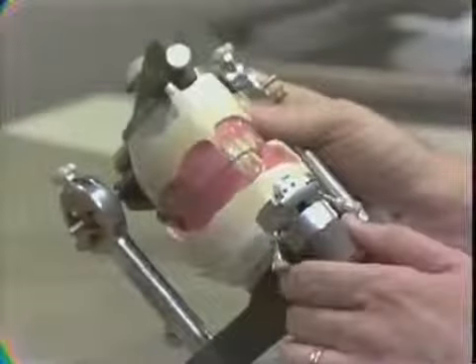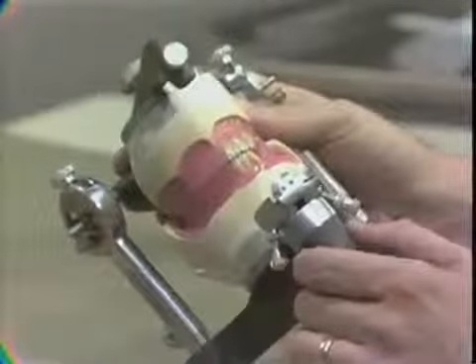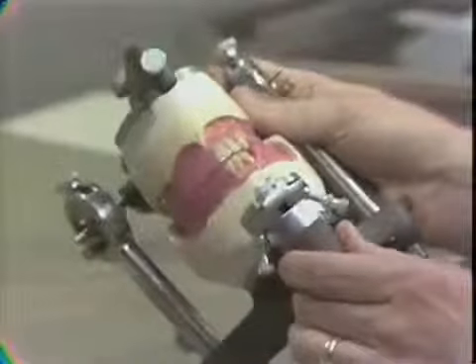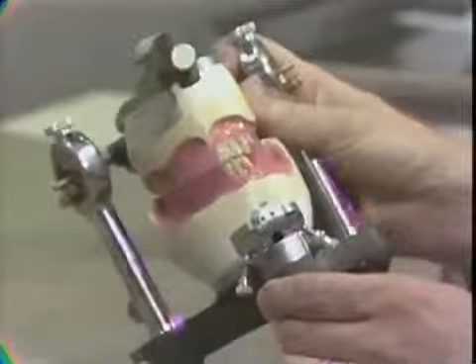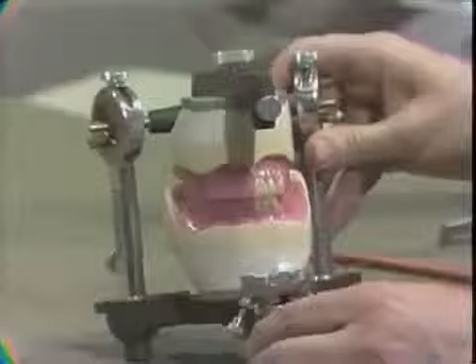In review, the maxillary and mandibular incisors have been arranged on one side of the midline with the desired incisal relationship of 1 millimeter of vertical overlap and 2 millimeters of horizontal overlap. After properly setting one side, the opposite side can be arranged.